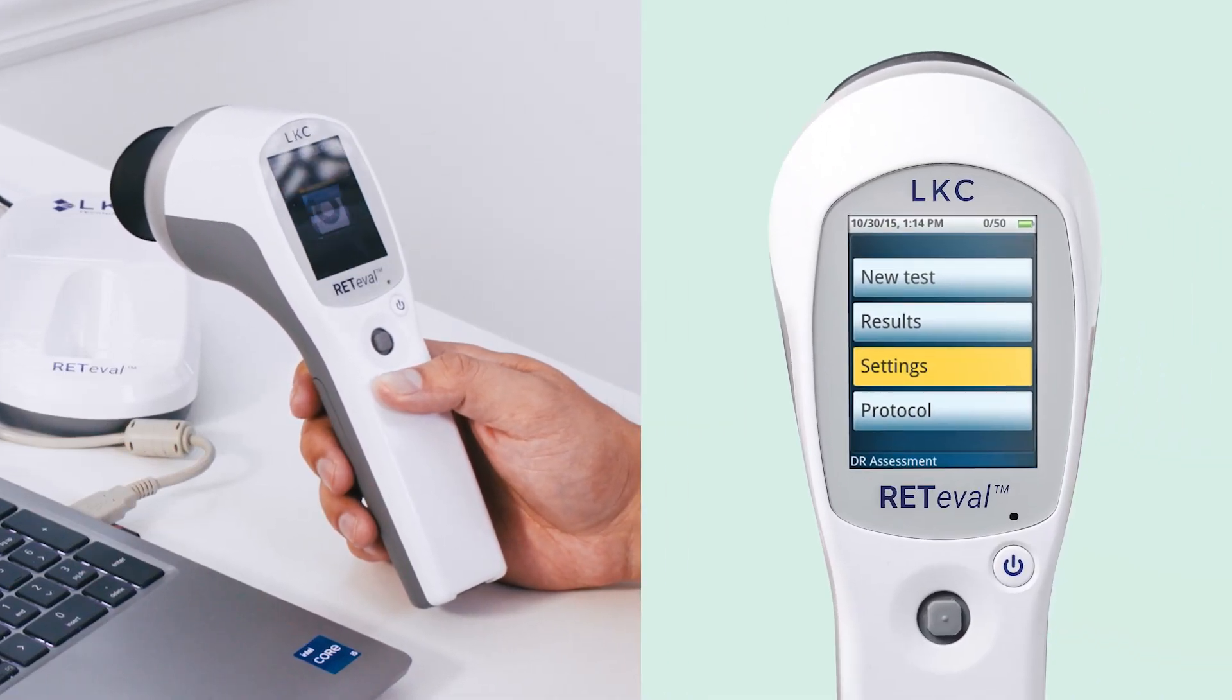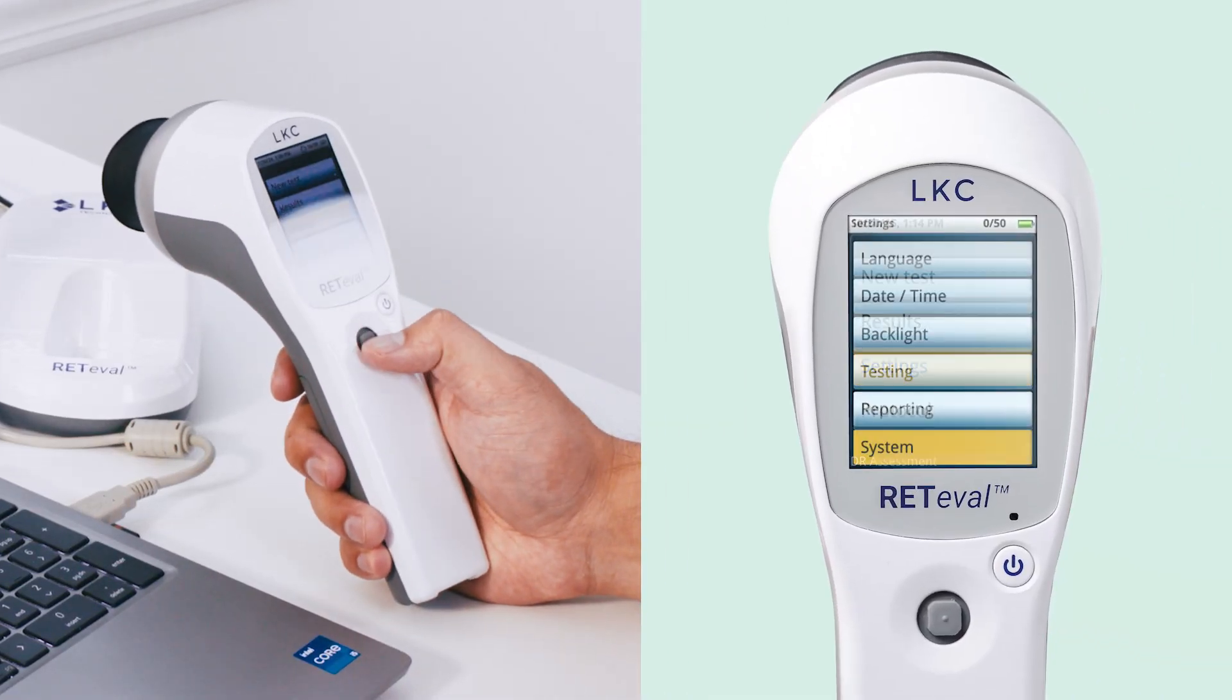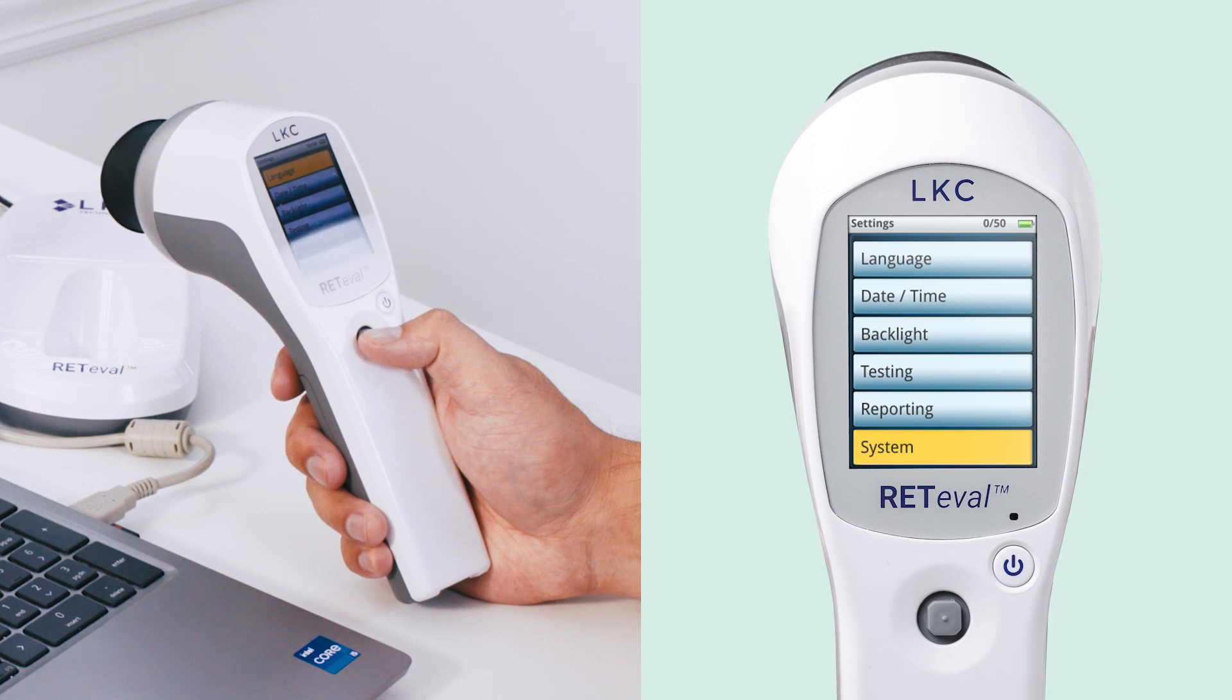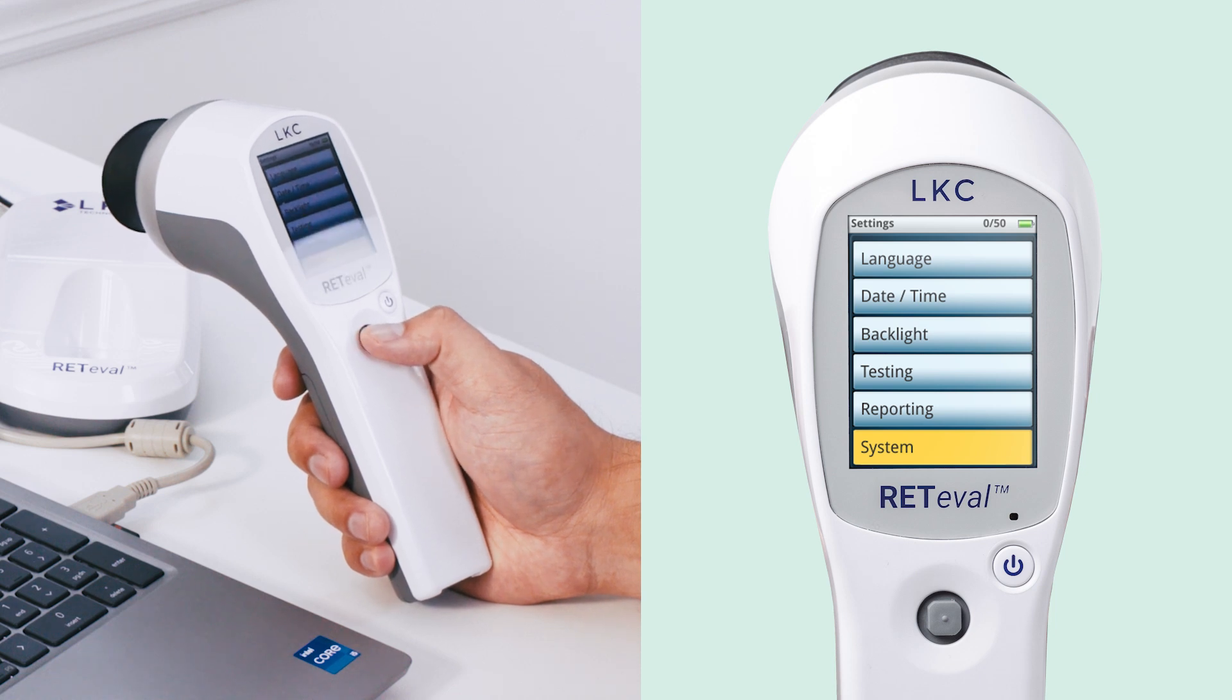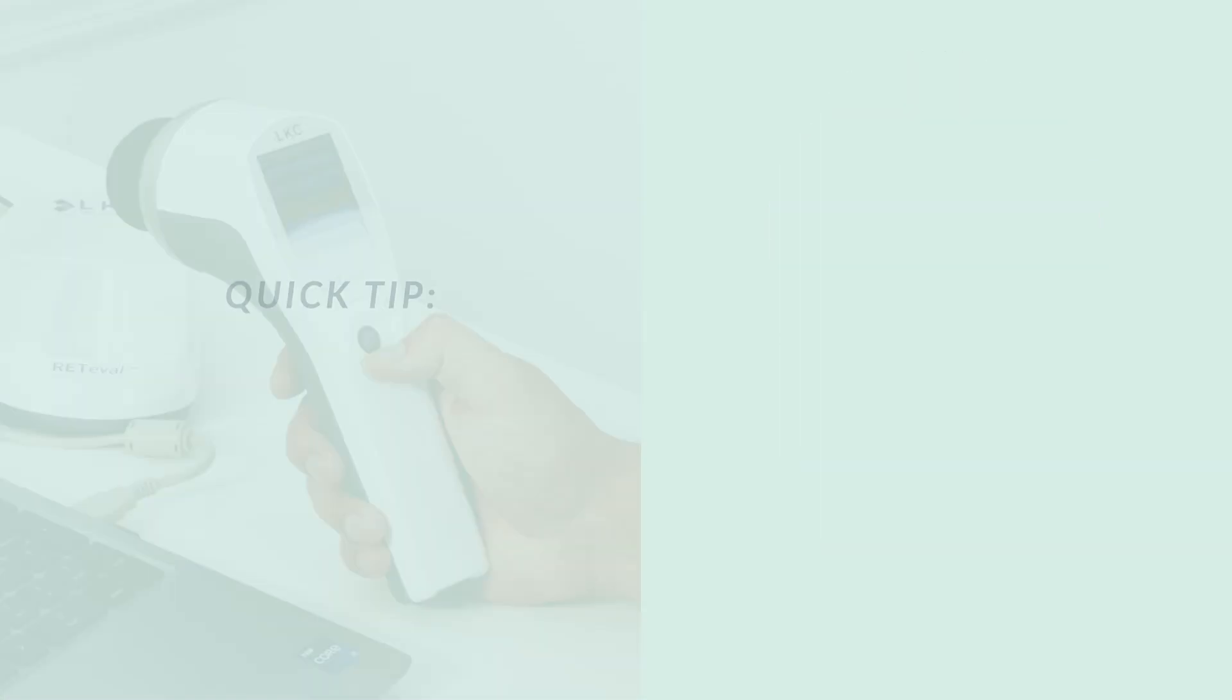Navigate to settings in the main menu, then select system on the next screen. Move to update firmware on the menu and select it.